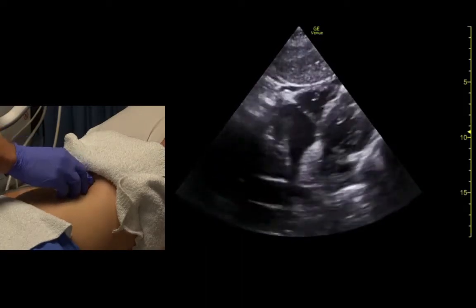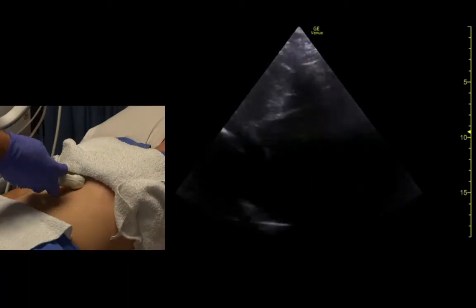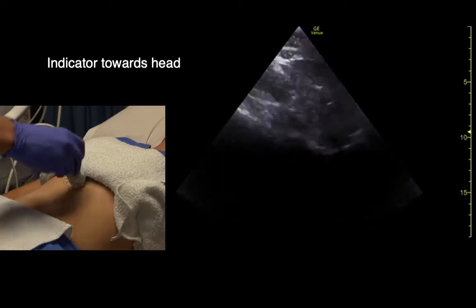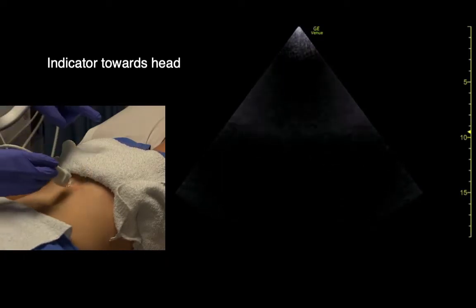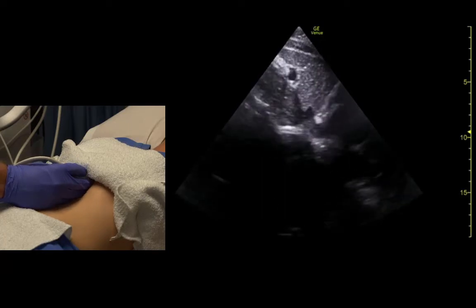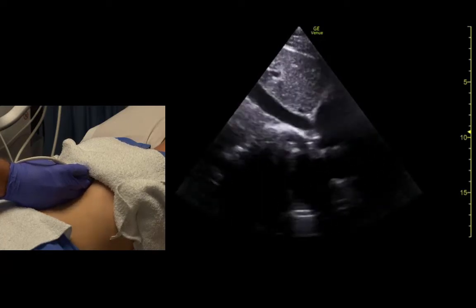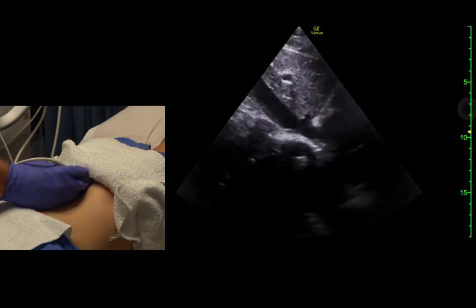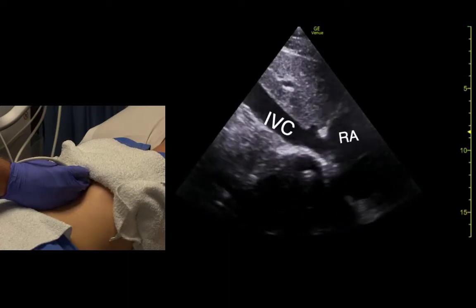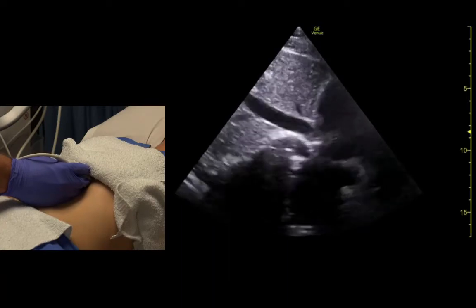Okay, relax. And then a lot of times we'll do the IVC view from here as well. So we just get in that position, indicator towards the head, rock up till we see the heart, and a little bit sideways. And we can see the IVC entering the right atrium and we see how it changes shape with respiration.